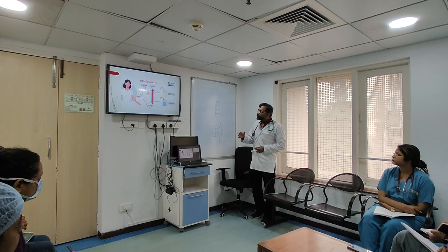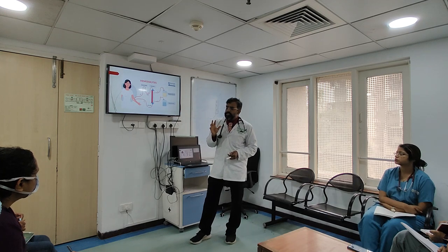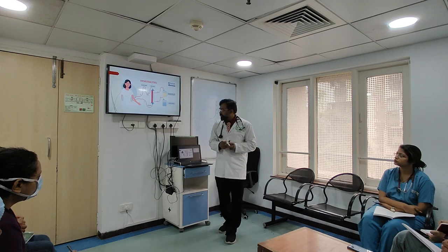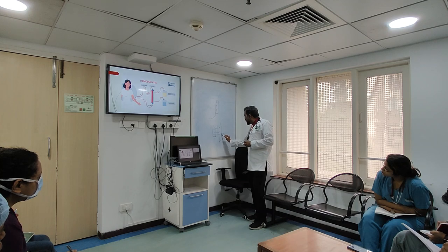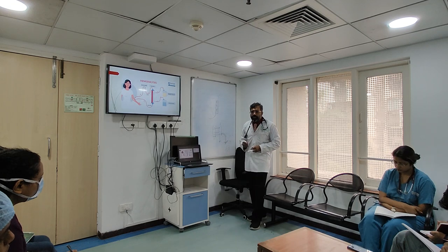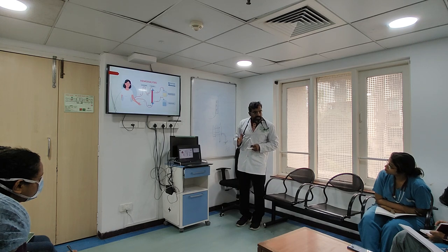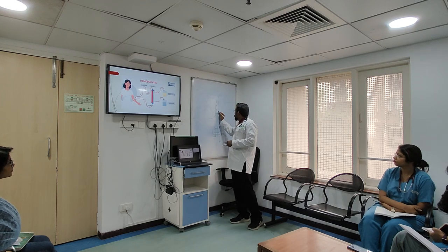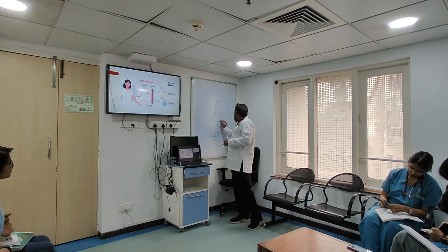Clear? That's why, whenever you talk about any kind of dialysis modality, we call it a counter current mechanism. The dialysate and the blood are counter to each other. And after this occurs, it is collected outside as an effluent. This word you should know: effluent. Any machine will have something called an effluent. The effluent is what comes out at the end, collected into a bag.